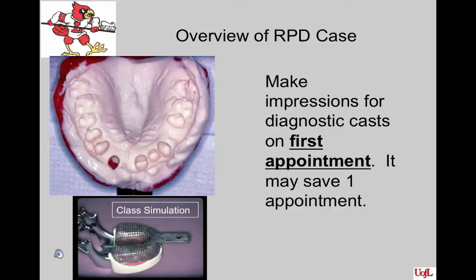A student is making a diagnostic impression of the patient's maxillary arch. Remember, as prosthodontists, we're interested in all the anatomy, not just the teeth. In this case of a maxillary arch, we want to see all the information back to and including the hamular notches. In this case, you can see a narrow palatal vault and the presence of a maxillary torus — both of these items may affect our final design plans for the partial. Sometimes we have tuberosity interference and can see this only after the time we try to mount the case. We have to record all the proper anatomy in the impression, pour the cast properly, and make sure not to trim off vital anatomy necessary for proper diagnosis.